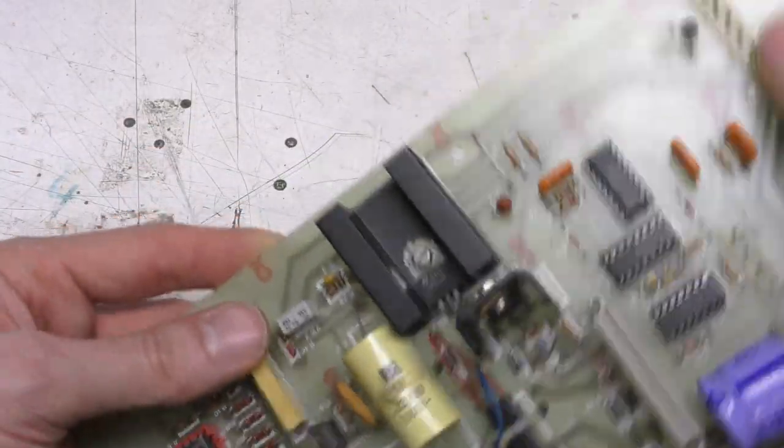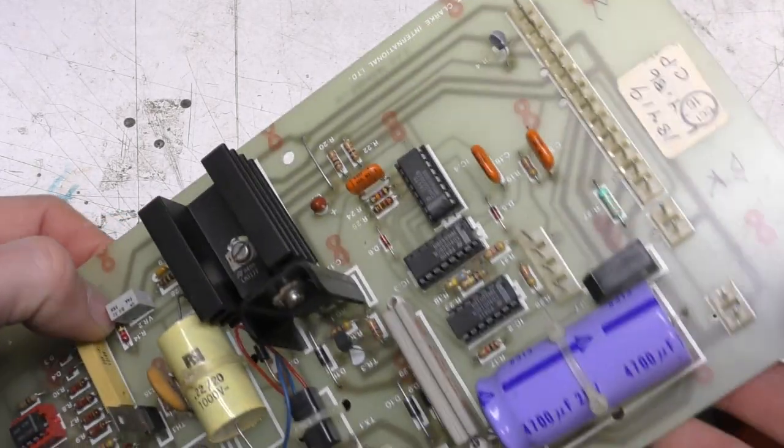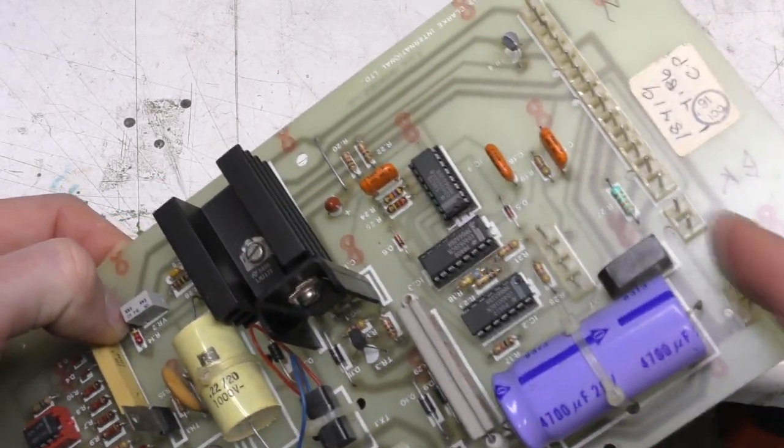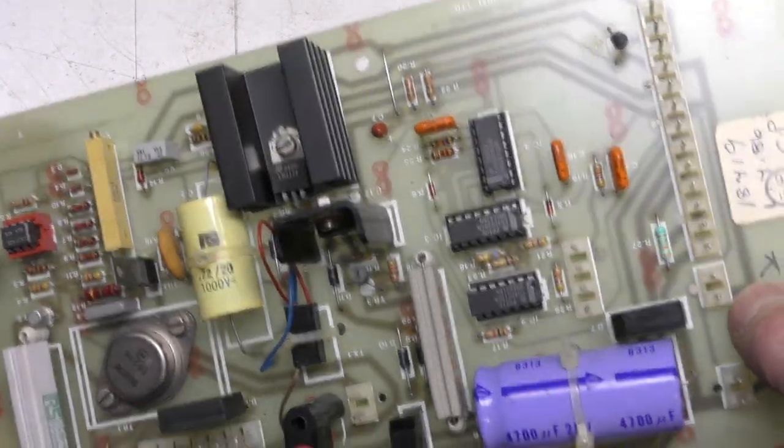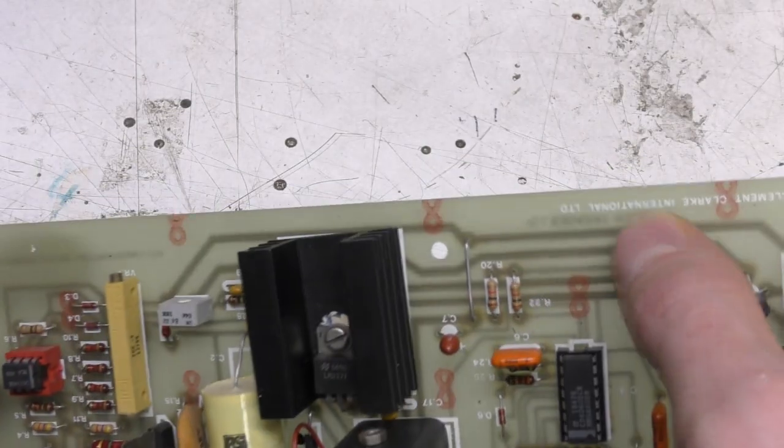Oh, the other thing is there's quite a few connectors on here, and there's a few connectors with the same pin count. They've used different colours to differentiate them, but they haven't bothered marking the colour on the PCB. You know, it's not like there's no silkscreen. Yeah, there's a silkscreen on this PCB, but they didn't bother marking the connector colours on them.